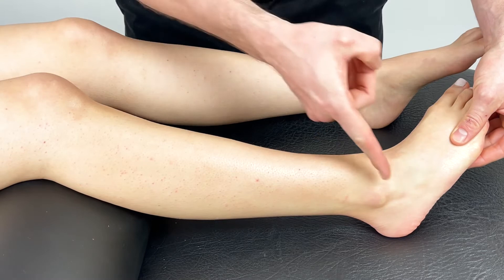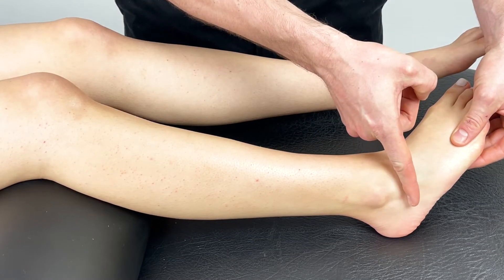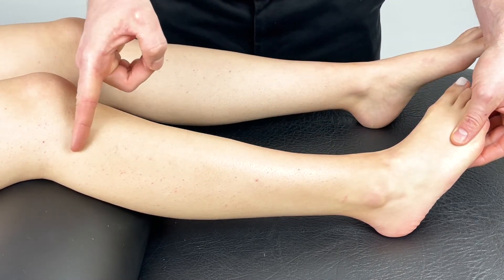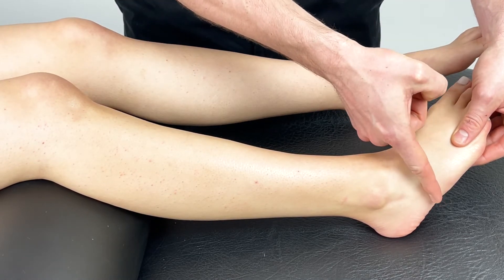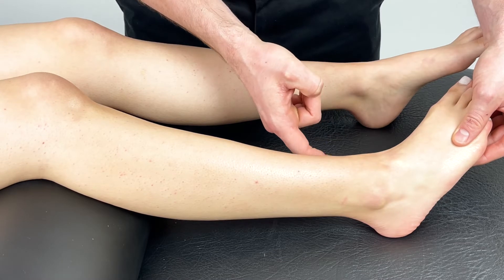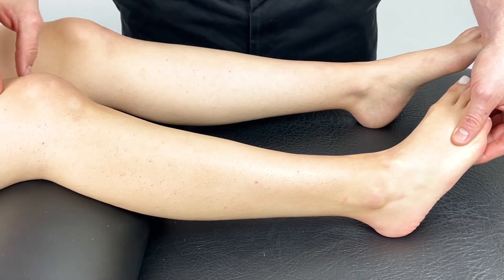Our first piece will be anchored on the lateral aspect of the heel and applied up toward the fibular head. Our second piece will be applied just next to the first and wrapped diagonally across the ankle, finishing on the medial malleolus.